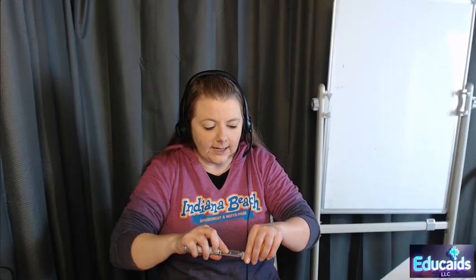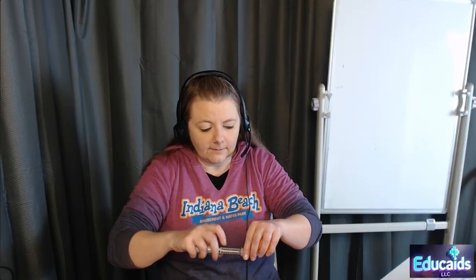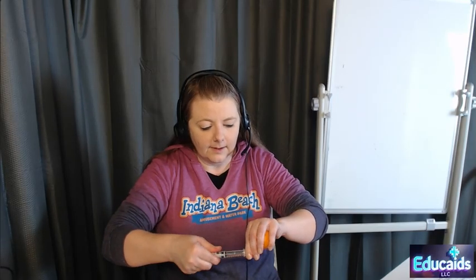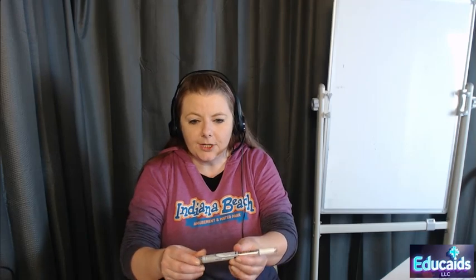We're going to righty-tighty it again. There we go. All right, we're going to kick it up to 2. You can see my 2 right there. Okay. We're going to prime it. There we go. And you can see just a little bit of insulin up there.